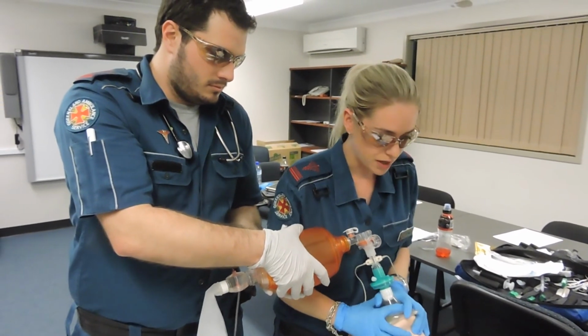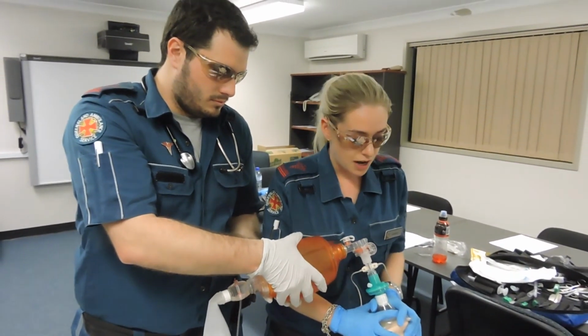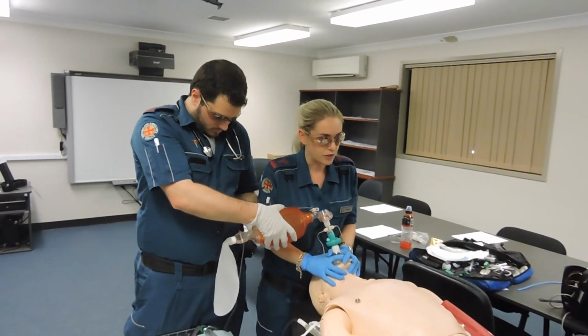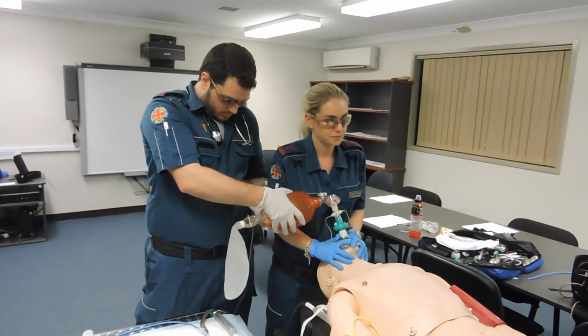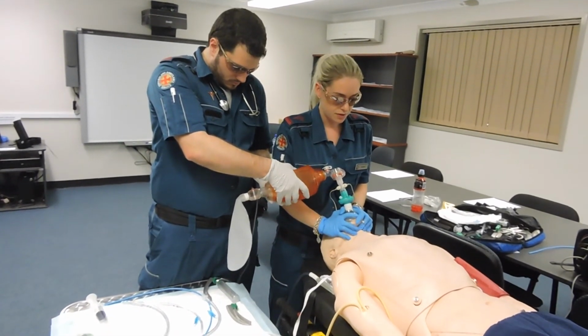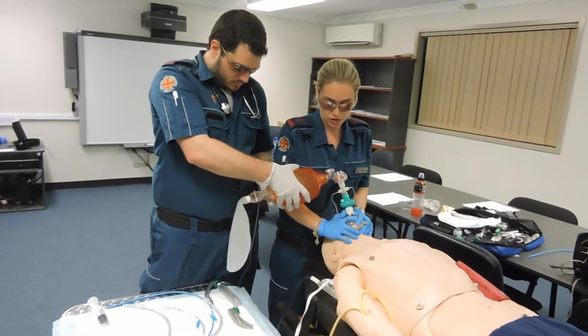Having trouble ventilating this patient. So at this point, we're attempting to pre-oxygenate. However, we're not getting very good ventilation. Here we go. Alright, so we're going to set up, we're going to continue oxygenating.